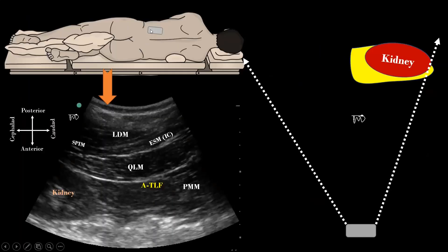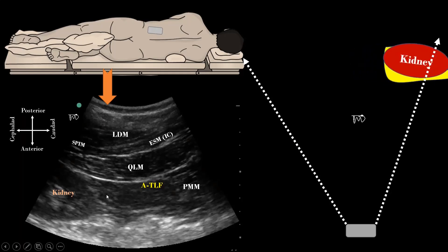The probe is placed in the desired location as described before. The cranial end of the transducer is tilted medially and the caudal end is rotated laterally to produce an oblique sagittal view. In this view, first identify the kidney with perinephric fat on the cranial end of the ultrasound image, which moves with respiration.